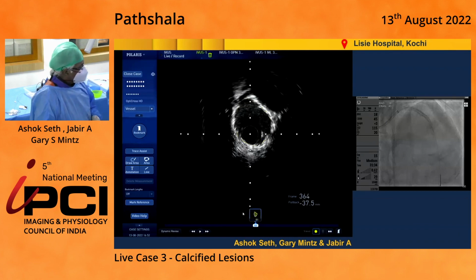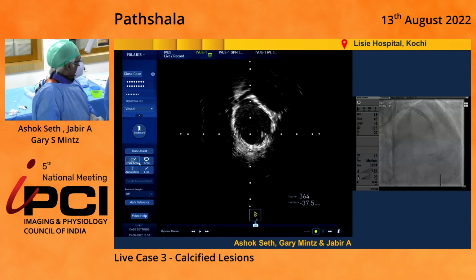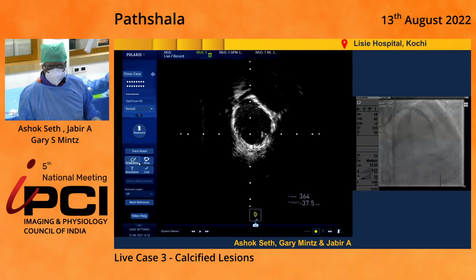We have a 3.15. Is it okay? Yeah, 3.15 is fine. So how would laser be at this stage? It's wide open, yes. Giving contrast at that time and seeing how it would. We are at 5.2 in your lab. Now we don't have laser here. I have laser with me in Delhi.